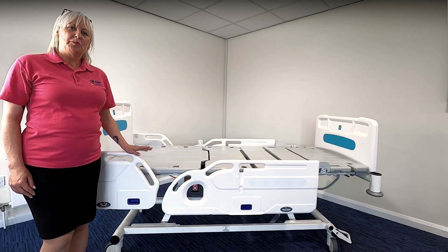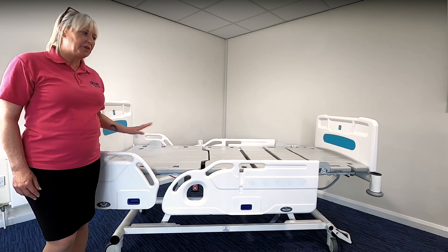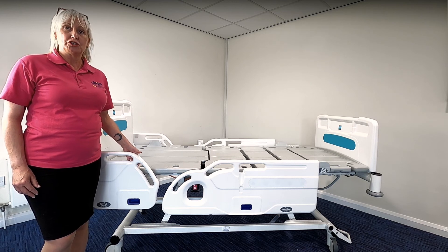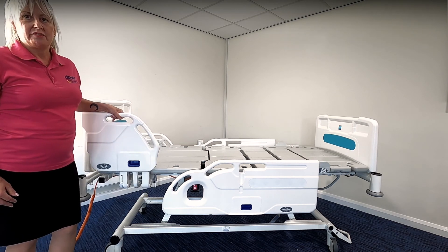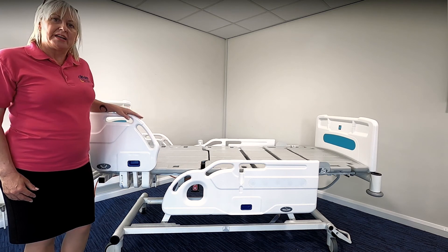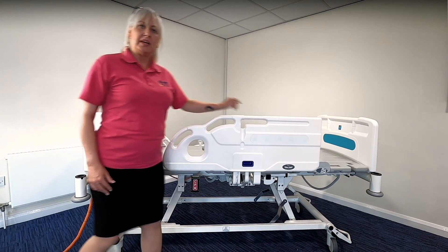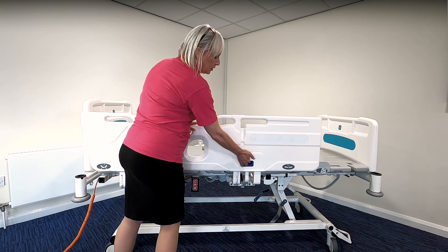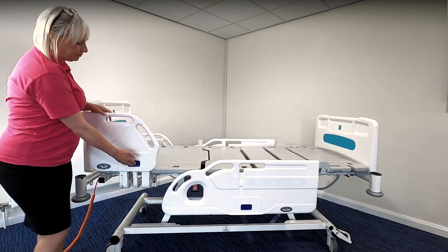The IQ bed is available with two types of side rails: cantilever side rails which are bars, or the split side rail version as with this model today. There is also a split side rail that has a patient control function set within it. To engage the side rails, simply use the aperture available, pull up until you hear a click and the side rail is engaged. The top side rail is attached to the backrest and will profile as the head of bed is raised and lowered. For the lower side rail, again use the aperture, pull up, and you will hear a click. To disengage the side rails, simply use the grab lever, pull it up, and allow the side rail to smoothly disengage under its own weight.